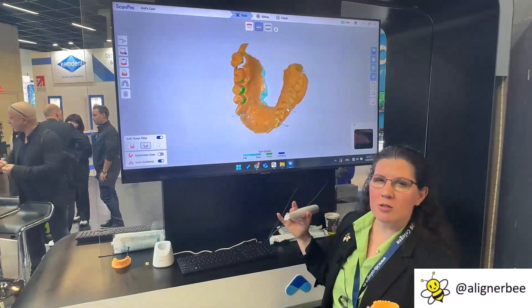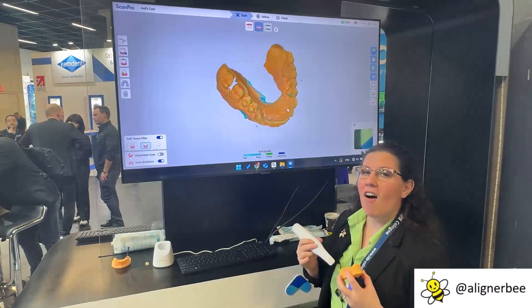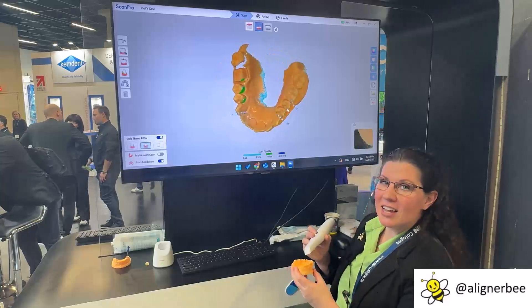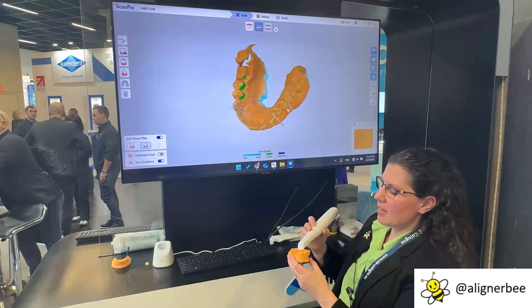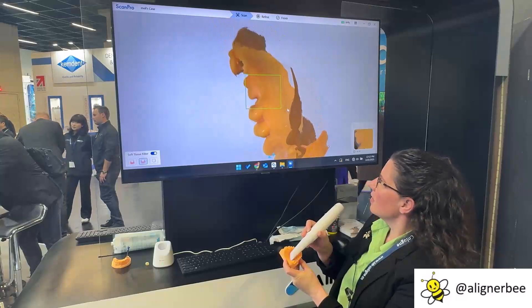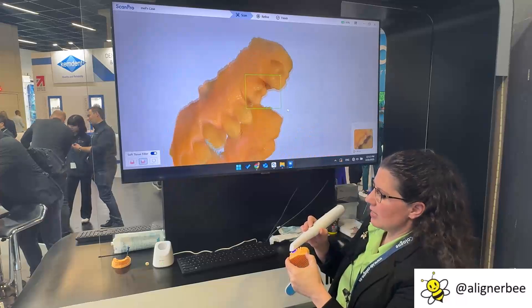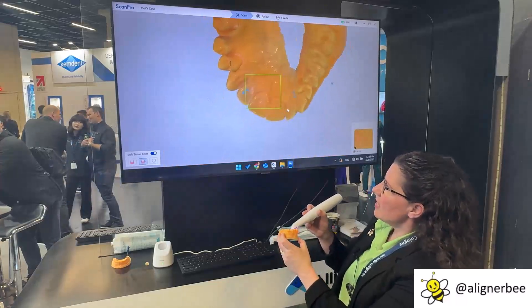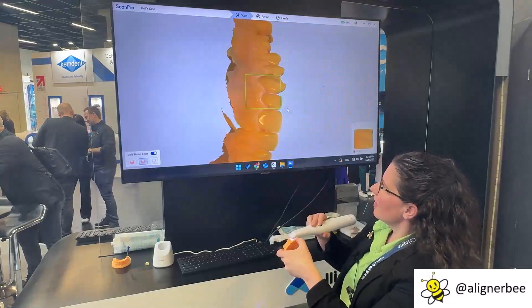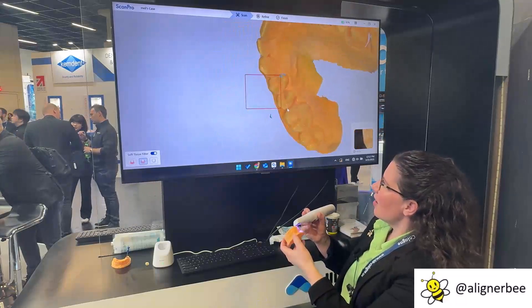The blue arrows indicating areas needing more data is especially useful to me in the orthodontic space, so that my team and I can make sure that we're scanning all of the areas of the teeth when we're scanning for our clear aligners. So let's go ahead and touch up this scan — I'm simply going to turn the scanner back on and go back and revisit those areas where we see the arrows. And as we can see, as we go over these areas, the arrows disappear.